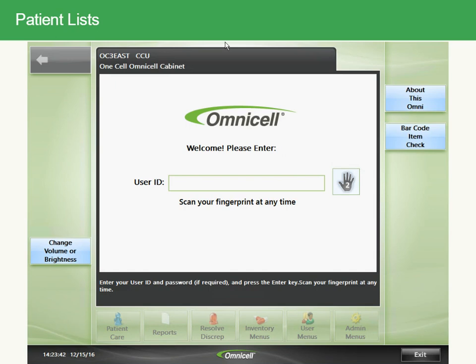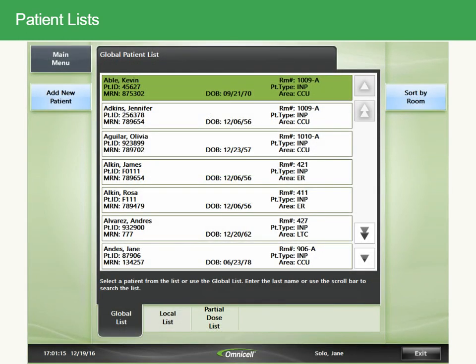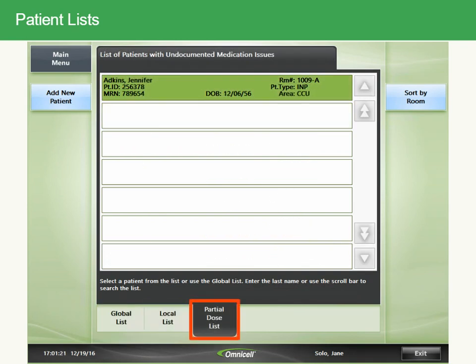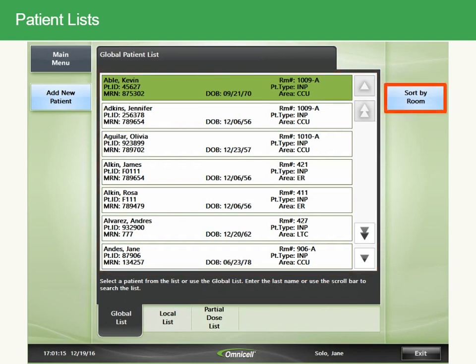After you log on to the cabinet, you'll see a patient list. There are three types of patient lists: a global list that includes all patients, a local list that includes only patients in your work area, and a partial dose list that includes only patients with undocumented medication issues. All lists are arranged alphabetically by patient last name. The Sort by Room button allows you to sort patients by room.